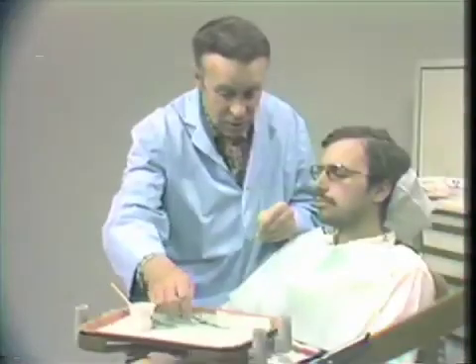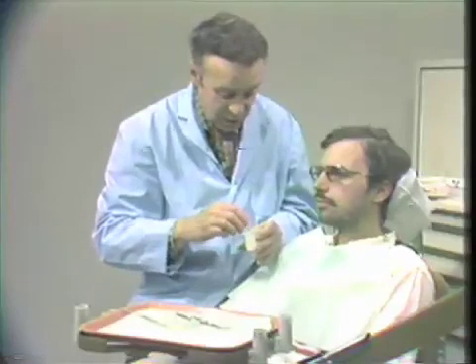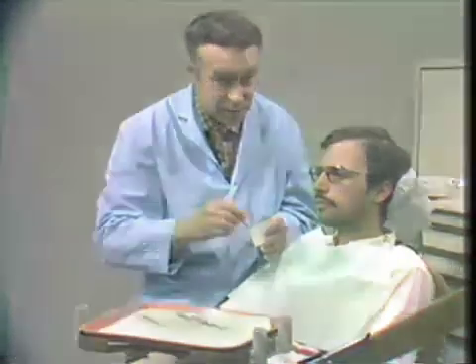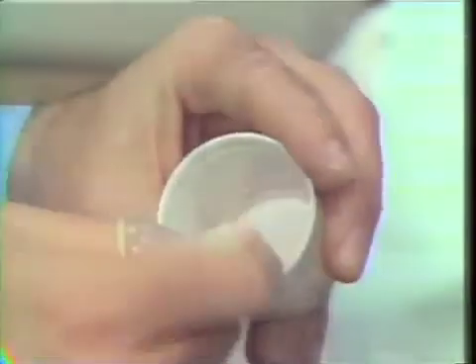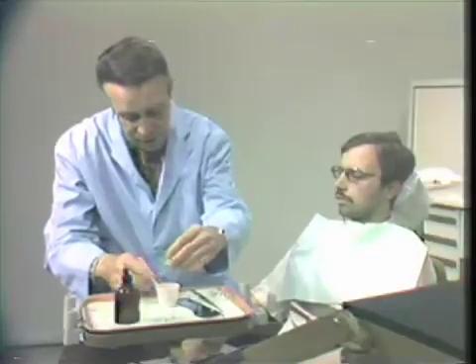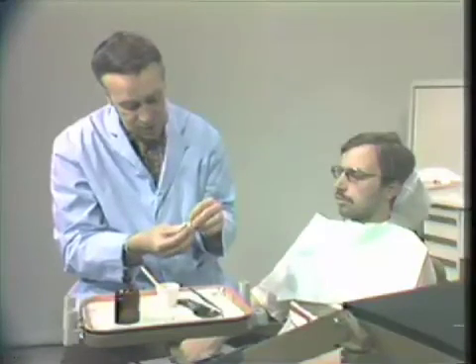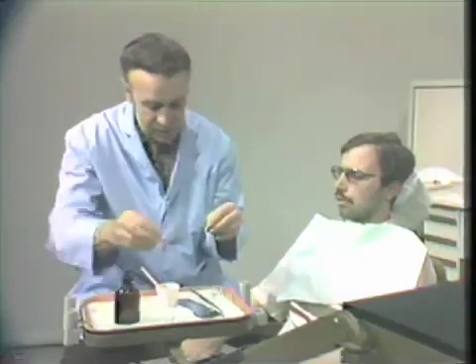We have elected to use the TMJ acrylic, which we demonstrated in a laboratory situation, and we will mix this and allow it to come to a heavy doughy stage prior to the time that we insert it into the patient's mouth. The acrylic has now attained a consistency where we can manipulate it in our hands, and as soon as it attains a slightly more doughy consistency, we'll be ready to put it into the oral cavity and make our platform.